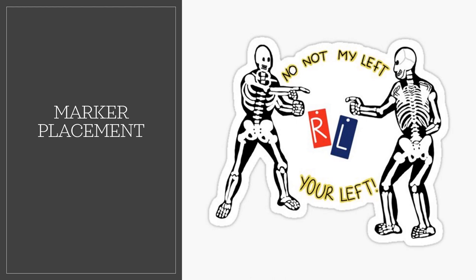Place the marker directly on the tabletop or IR whenever possible in the face-up position. This will avoid distortion and magnification, prevent scatter radiation from undercutting the marker, and ensure the marker will not be projected off the IR. Do not place the marker directly on the skin. And are annotated markers correct? You should not be using annotated markers.